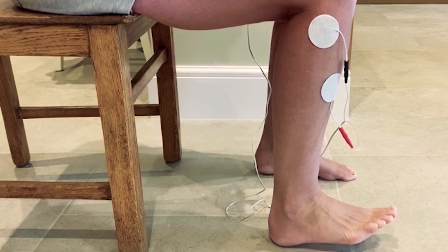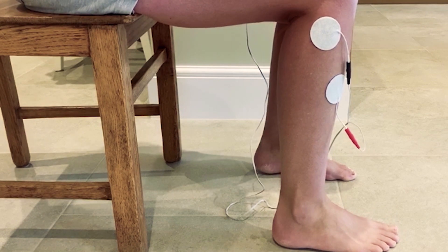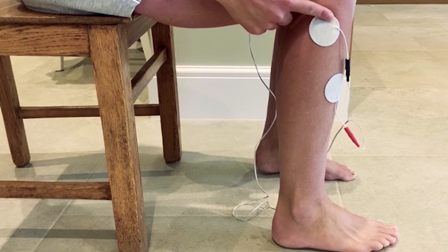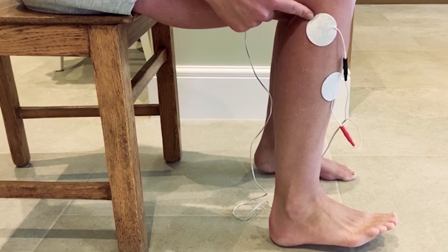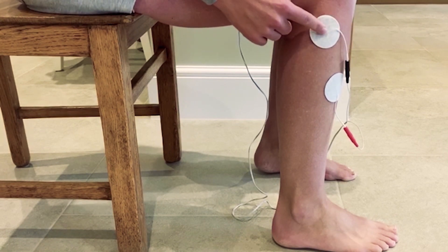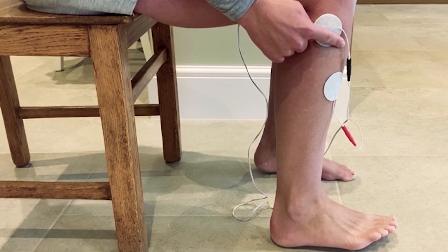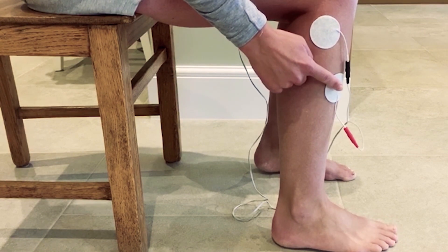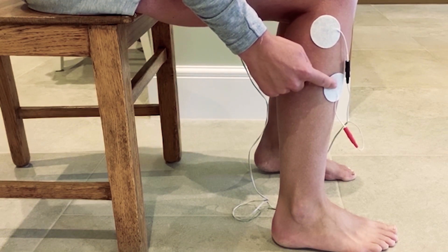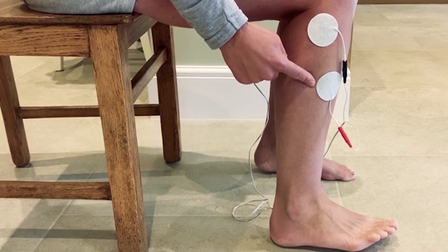You can see the stimulation coming on. If you find you need more eversion, move the top electrode slightly up and back. If you want more inversion — where the ankle turns in — try moving the top electrode slightly down and in. You can also, for more eversion when the ankle turns out, try moving the lower electrode slightly further round to the side of the shin.